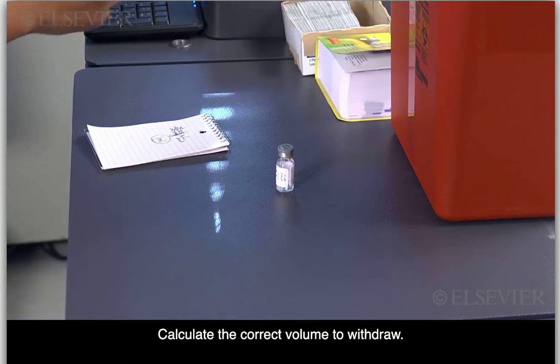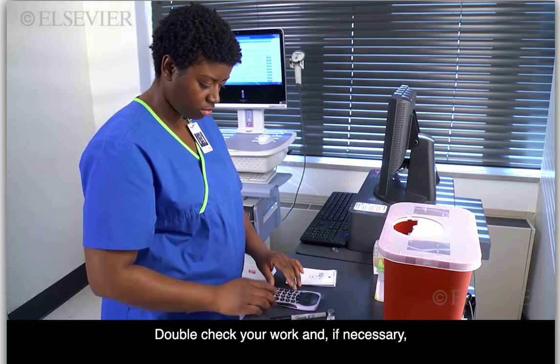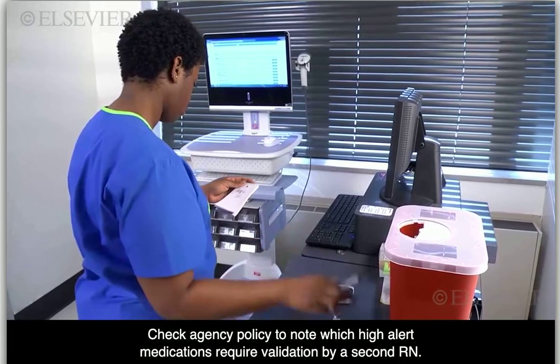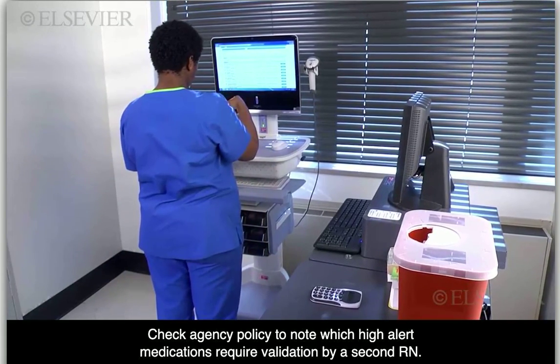Calculate the correct volume to withdraw. Double-check your work and, if necessary, ask another registered nurse to check your calculation. Check agency policy to note which high-alert medications require validation by a second RN.